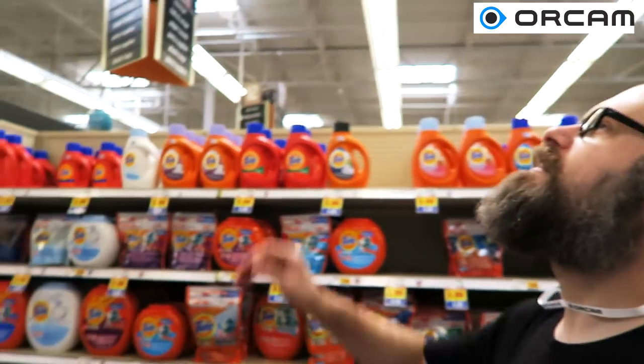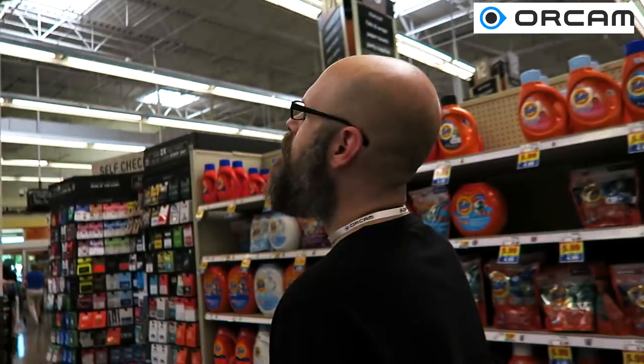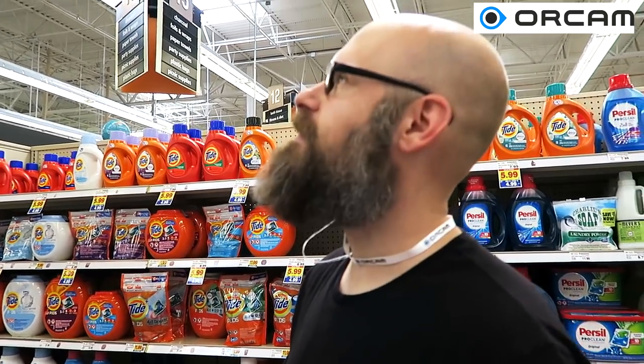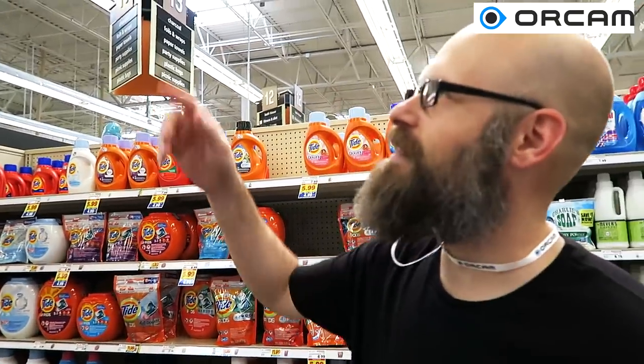Okay, here's another one — let's try this. Wow, I think it got all of it: brooms, mops, light bulbs, storage containers, household supplies. Yep, awesome — except for laundry supplies, but I think it may have even said that. It said a lot. Awesome — so it read that sign all the way up there. Pretty cool.